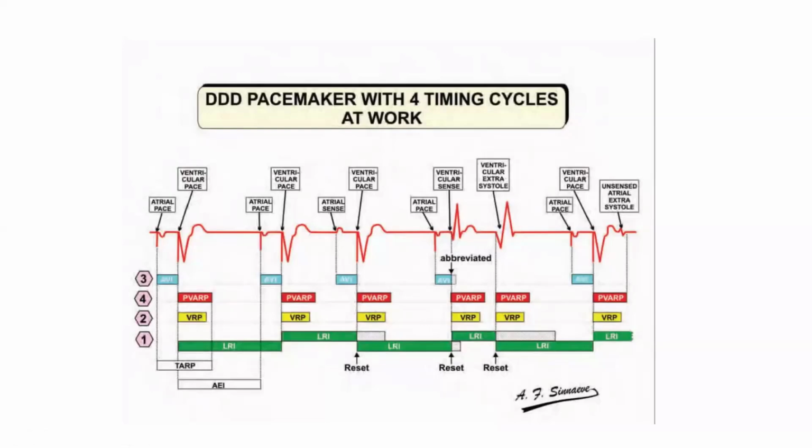And this is a very important observation if you have young colleagues who are not experienced with pacemakers, and you have a patient with complete heart block with heart rate about 30, and you implant a dual chamber pacemaker, and the patient gets out and they find the patient's heart rate is 100, and they ask you, how did you program this device? How much rate do you put? You say 60. How is it 60 and the heart rate now is 90 or 100? Because it's tracking, it's following the P wave. And this happens by the AV interval and other intervals we described.